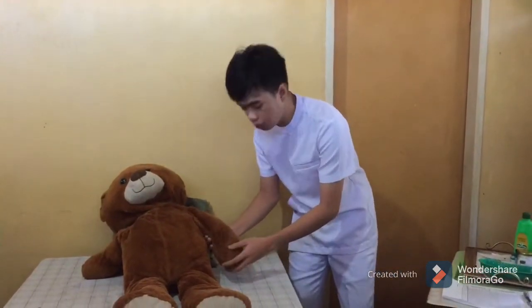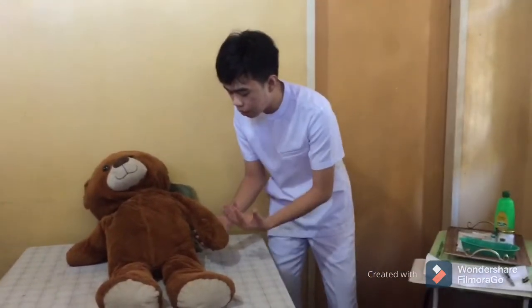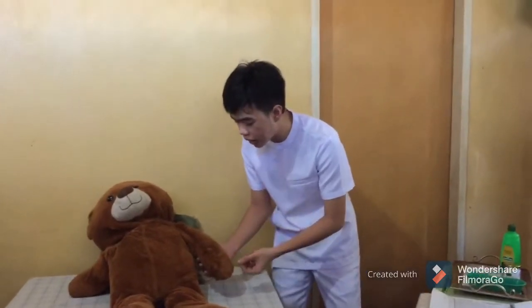Again, we are going to assess the appearance of the area where we are going to do a skin test. We are going to examine if there's a presence of lesion, because if there is, it can be a hindrance in absorption of our medication. Then we are also going to assess the specific drug action and the expected outcome or response, so that we are able to share with the client the possible side effects of that drug. Then we are also going to assess the client's knowledge on drug action and response.